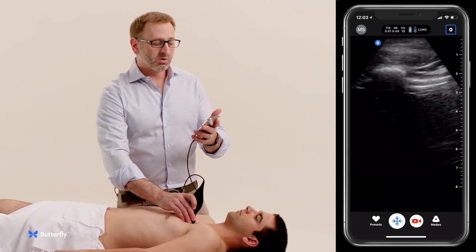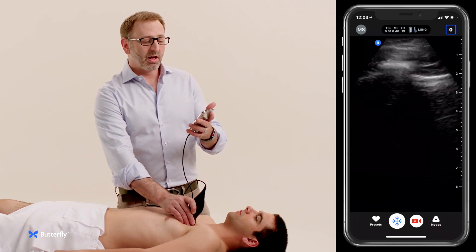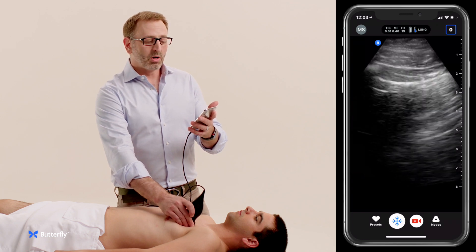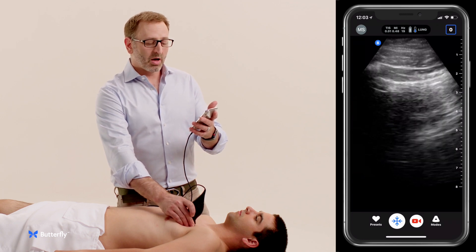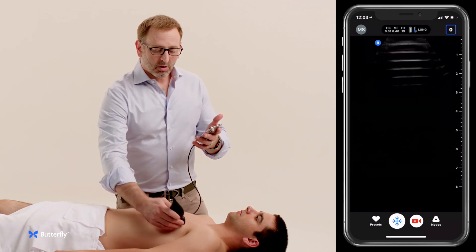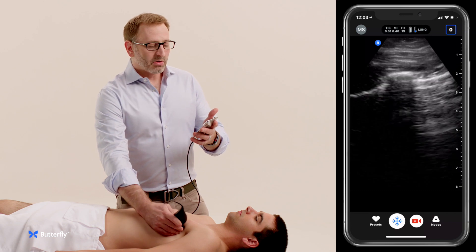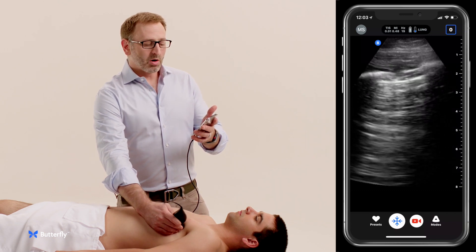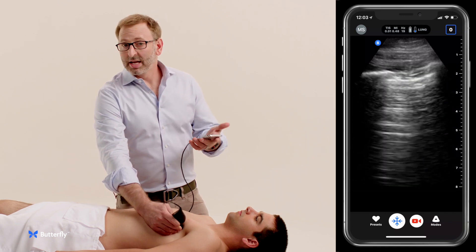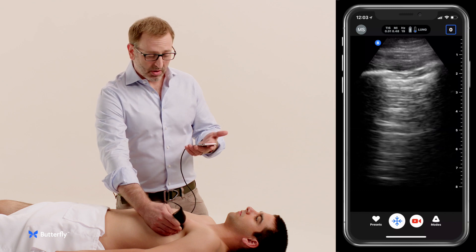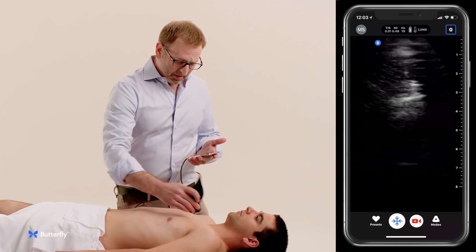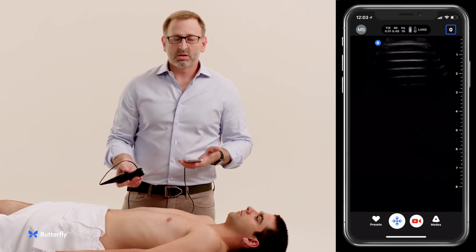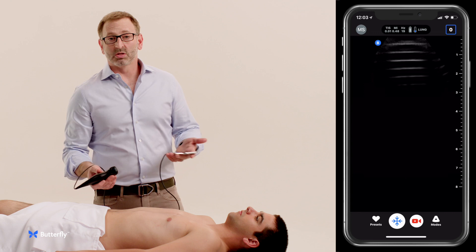We'll place the transducer similarly on the left chest and get the same view of normal lung sliding and A lines. We go a little bit more lateral on the chest wall on the left to avoid the heart, getting another view of lung sliding and A lines showing no B lines. In this case we've really seen no cause for this patient's shortness of breath.